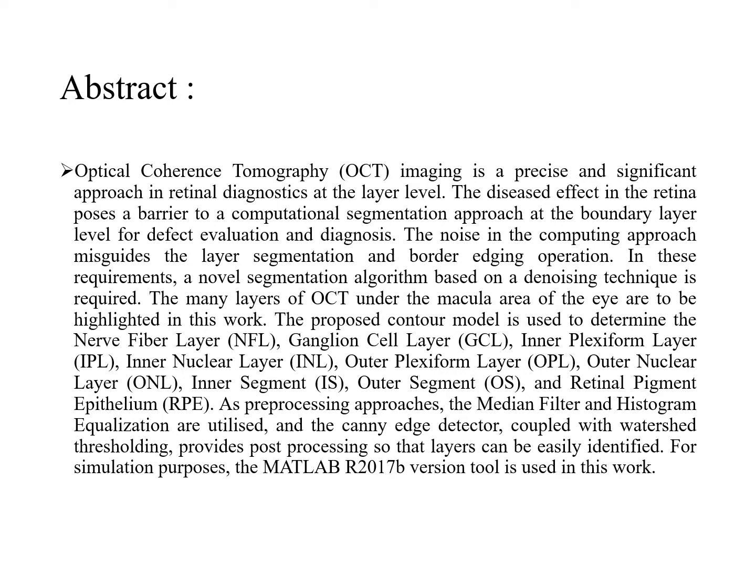In pre-processing approaches, the median filter and histogram equalization are utilized, and the canny edge detector coupled with watershed thresholding provides post-processing so that the layers can be easily identified.